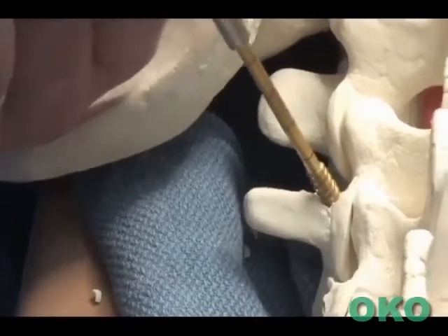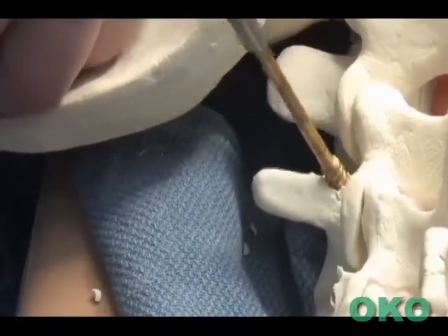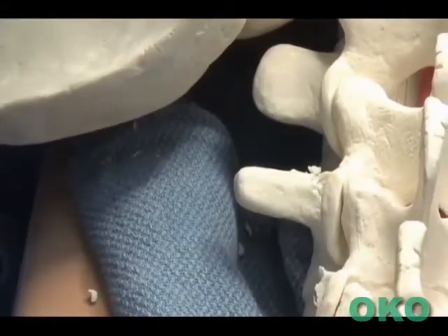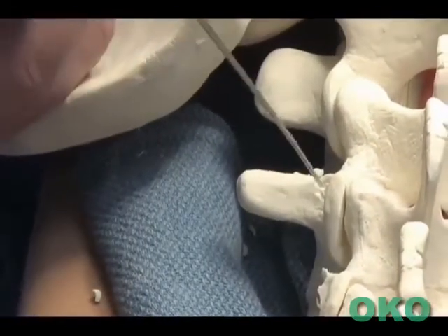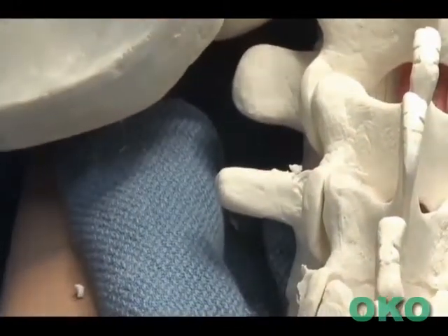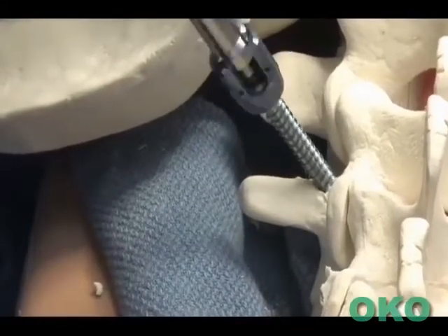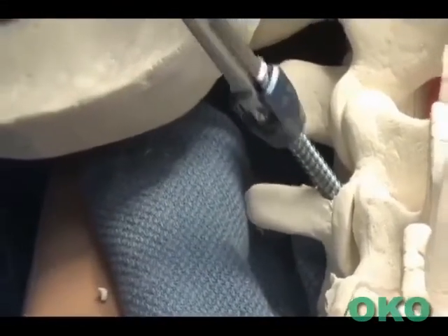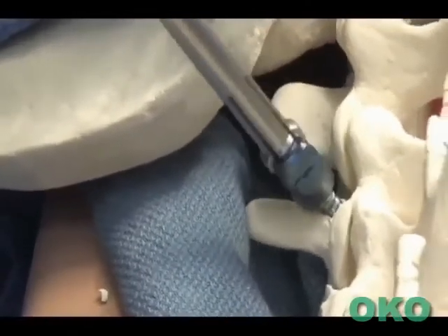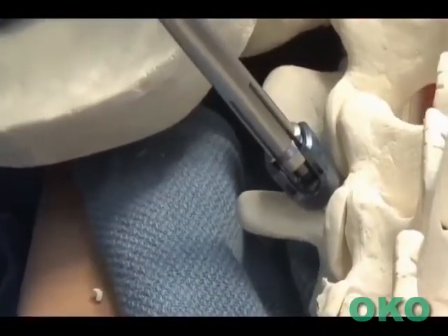The pedicle is then tapped in the trajectory. The ball tip feeler is used once again to ensure there are no cortical breaches of the pedicle, as well as to measure the depth of the screw. The screw is then applied in the tap trajectory, ensuring that the polyaxial head is free and mobile.